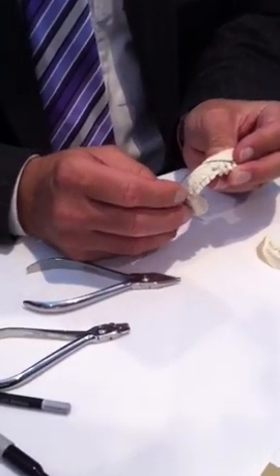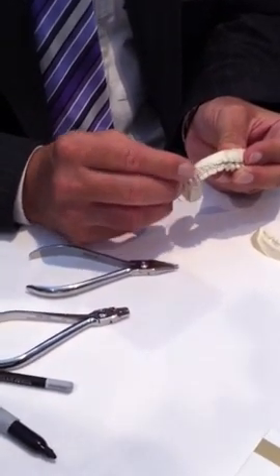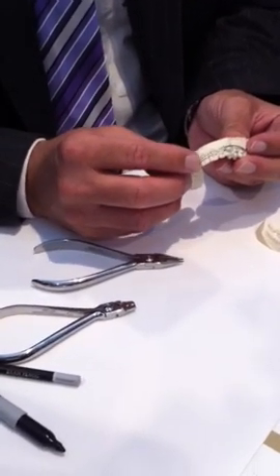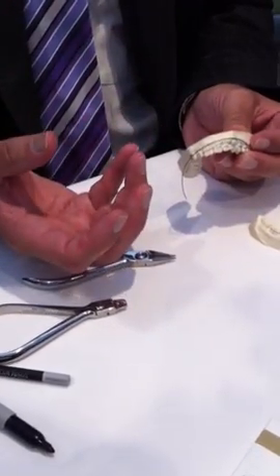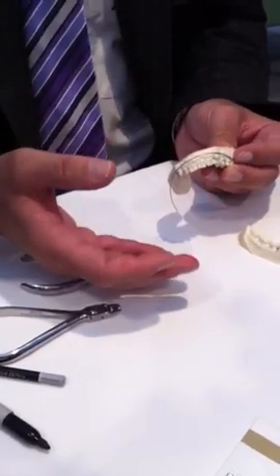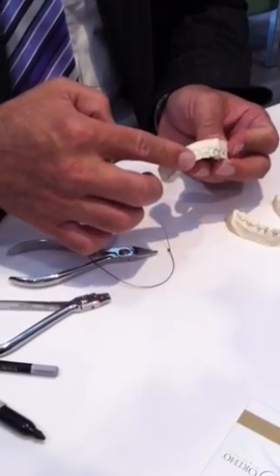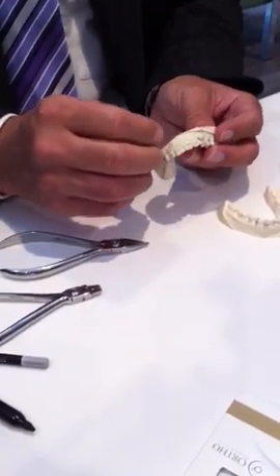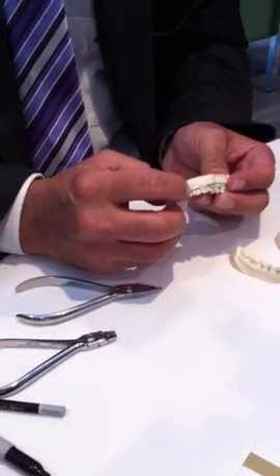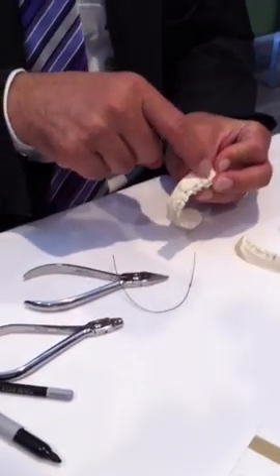People ask: do you place this directly into the brackets, or do you use a piggyback technique? Well, it depends on what you're trying to achieve. You can place it directly in the brackets, and that's why I don't use a big size TMA wire, particularly if you've already done some levelling and aligning. But if you haven't done levelling and aligning, you could have a base wire doing your levelling and aligning, and then have this as a piggyback wire — you tie the intrusion arch to the main wire at one-point contact. That would mean you'd need a molar tube that has two openings: a double molar tube.